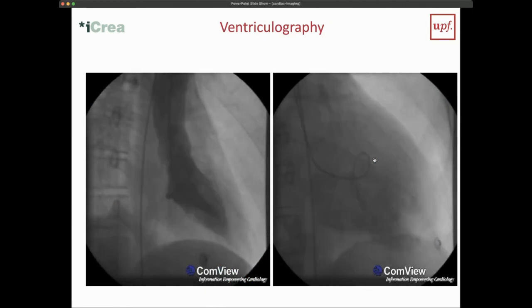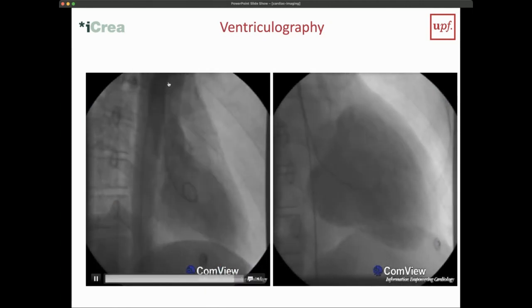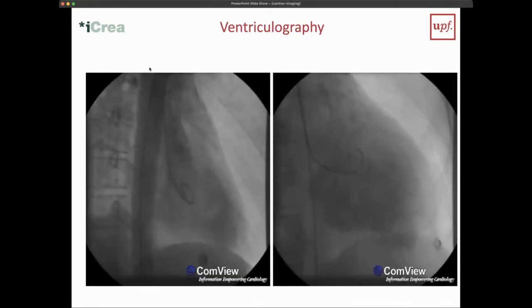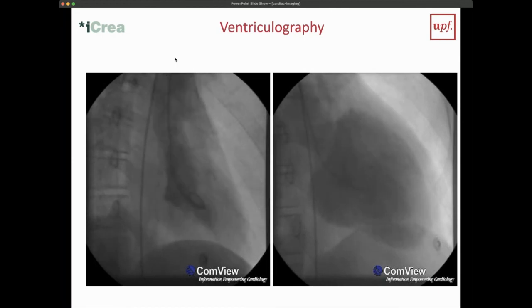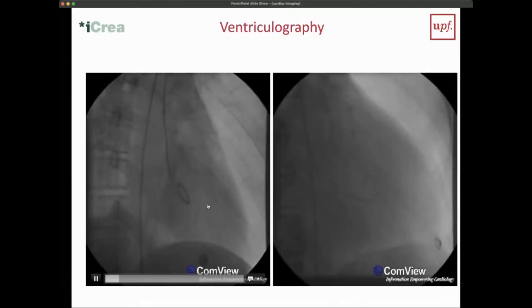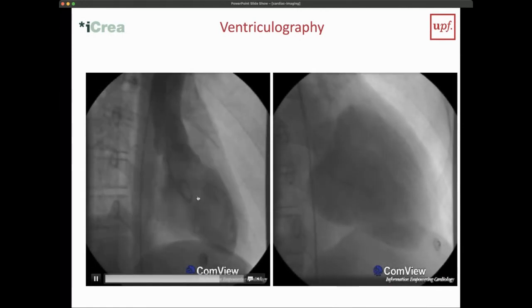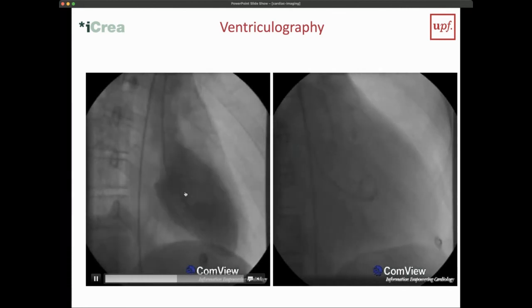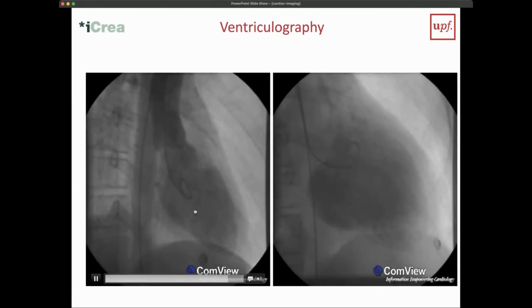And here are some examples. This is an example where we have a catheter coming from below. The catheter comes here from below, is going through the aorta. On top here it goes through the aortic arch, bends, comes down. And in this case, the catheter has been brought inside the left ventricle. You see that this catheter is rounded here. It's what we call a pigtail, so that the edge is, of course, not sharp, so that we don't damage anything within the ventricle.